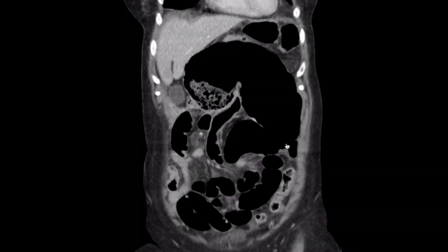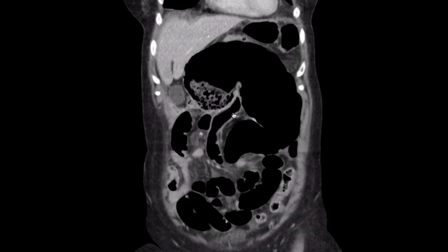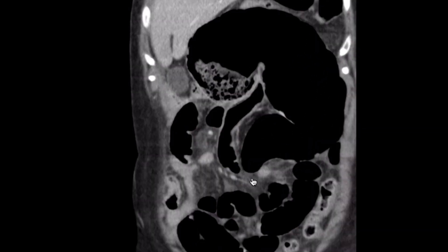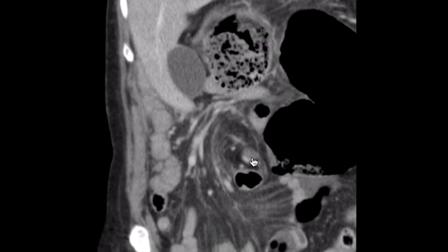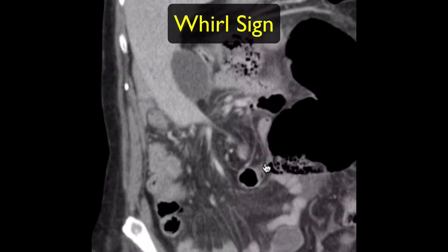The coronal images also show these features. Here you can see the caecal pole up on the right side just underneath the liver, and then the cecum leading to the ascending colon which is collapsed. Gas is refluxed from the cecum through the ileocecal valve into distal small bowel loops, and this has the effect of decompressing the cecum. If you follow the bowel you can again see the twist of the bowel, the mesentery and the associated vessels.